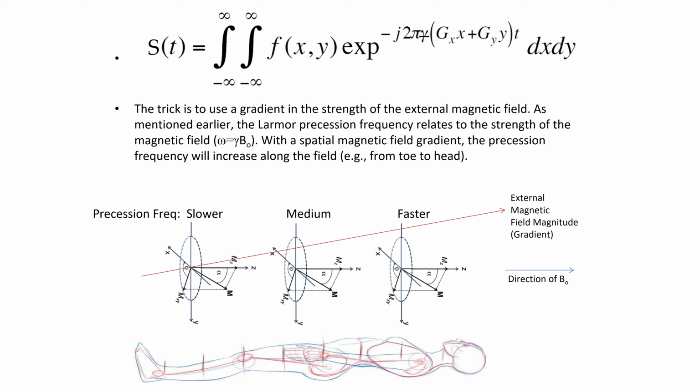If you want, you can think of an analogy here, an analogy of choir singers. The T2 signal is kind of like me being the choir director and hitting the choir with a radio frequency pulse that tells them to sing a note for as long as they can. The strength of the T2 signal is represented by how long each person holds the note.